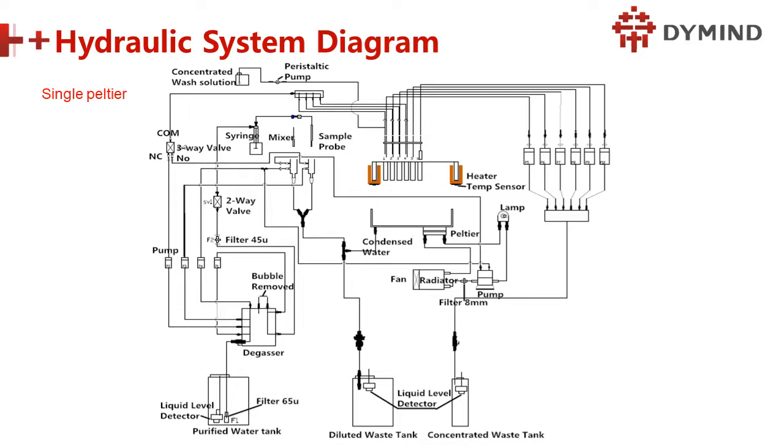Just a moment. We are seeing the water. You can see here is the inlet. Okay. So this is the difference. You can see the diagram here, but they are not mixed together. The water will not mix together. Okay. Continue.